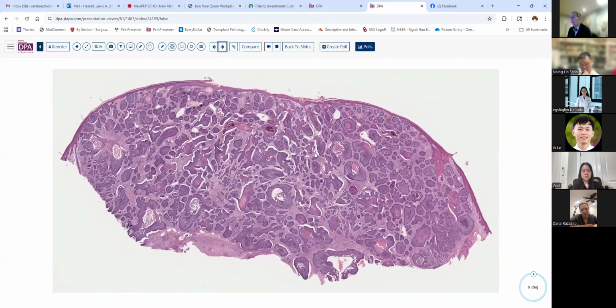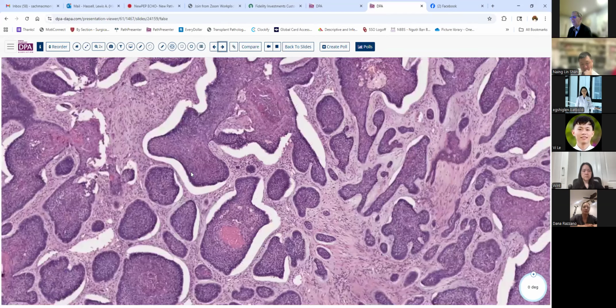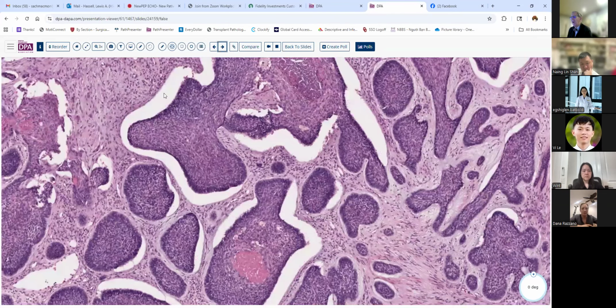And you can tell that it's basal cell even at this magnification, because look at these big giant retraction clefts you've got between the epithelium and the surrounding stroma. If that isn't the classic hallmark of a basal cell carcinoma, I don't know what is.